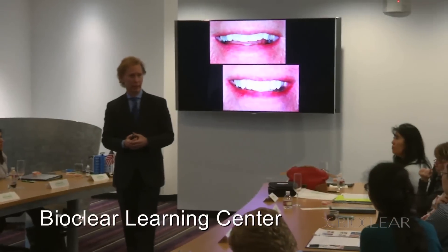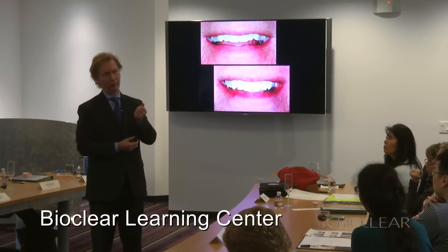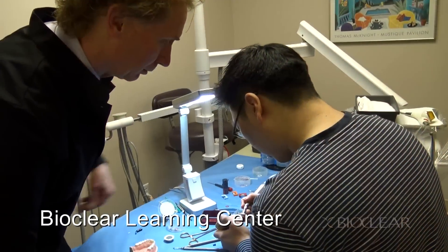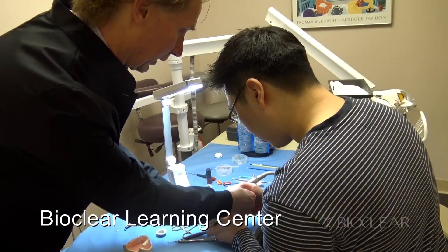The BioClear 360 veneer matrix is available as a complete kit. Dentists are required to attend a one or two day BioClear certification training course.